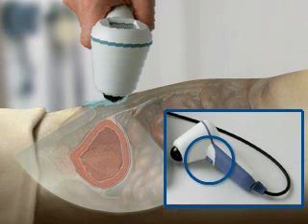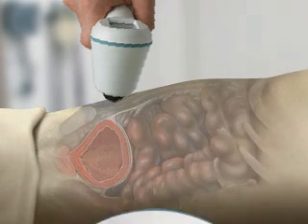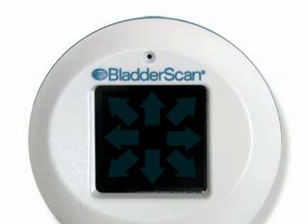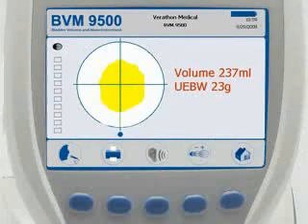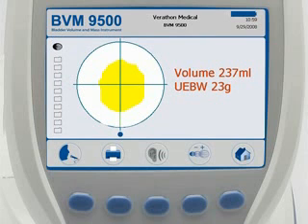When you hear a beep, the scan is complete and a bladder volume measurement is displayed. The scan is on target when 8 arrows flash on the probe screen and the bladder image is centered in the crosshairs of the aiming display on the console screen.